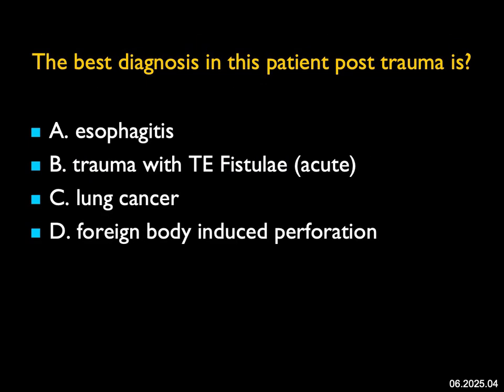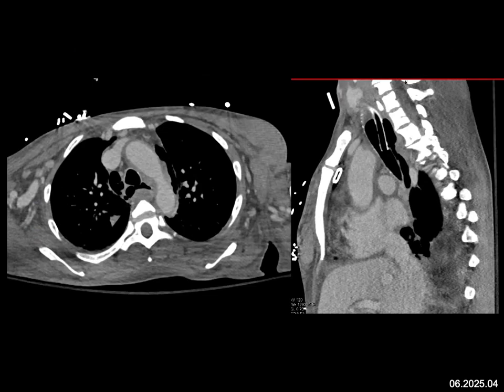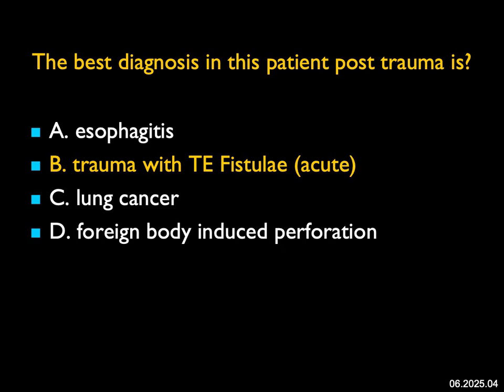The best diagnosis in this post-trauma patient: the patient is intubated, but I see the trachea and there's no clear plane between the trachea and the esophagus. Air is tracking posteriorly, and there's thickening around the trachea and the esophagus, visible on the sagittal view as well. This is not the appearance of esophagitis, and it's not lung cancer. I don't see a foreign body — though with intubation you could perforate the trachea or esophagus. But I don't see a lot of air in the neck, which you would expect. Rather, I see what appears to be communication of the trachea and esophagus.